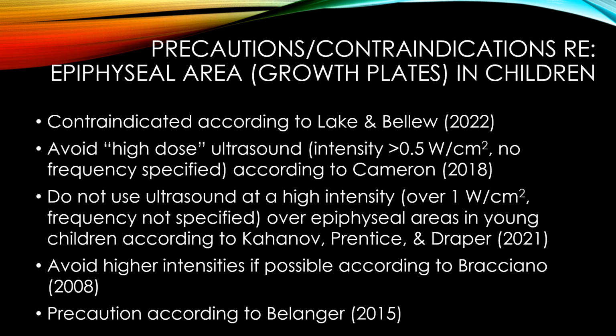Again, given that at least one author calls it a contraindication, and given the risk, I would just not do therapeutic ultrasound over growth plates in children who are not yet skeletally mature. There's always another way to accomplish what you want to accomplish, and so why take the risk?